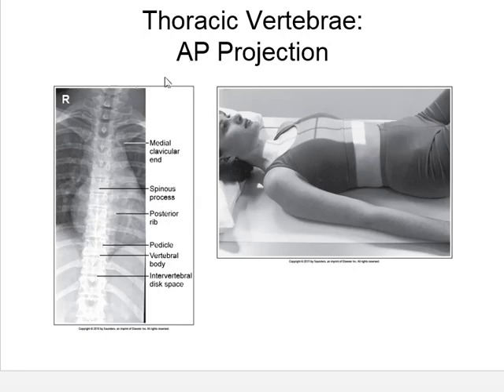Compensating filters, what we would do is we would put the fat end of the compensating filter over the upper portion of the T-spine, thin end over the lower portion of the T-spine to try to even out the tissue density difference between the upper and the lower. So just some things that we could do to even all that out.